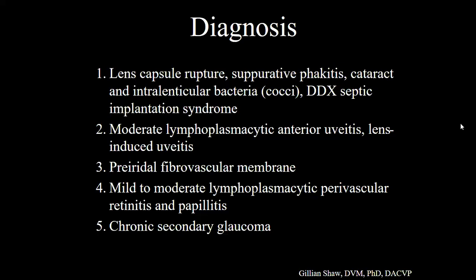So I think it fits with a pattern of us not seeing a clear corneal penetration. And also sometimes the lens capsule rupture tends to be more equatorial to posterior, which means, if the cat claw reaches through the lateral aspect of the sclera, you get towards the posterior chamber and towards the lateral or equatorial or the backside of the lens.